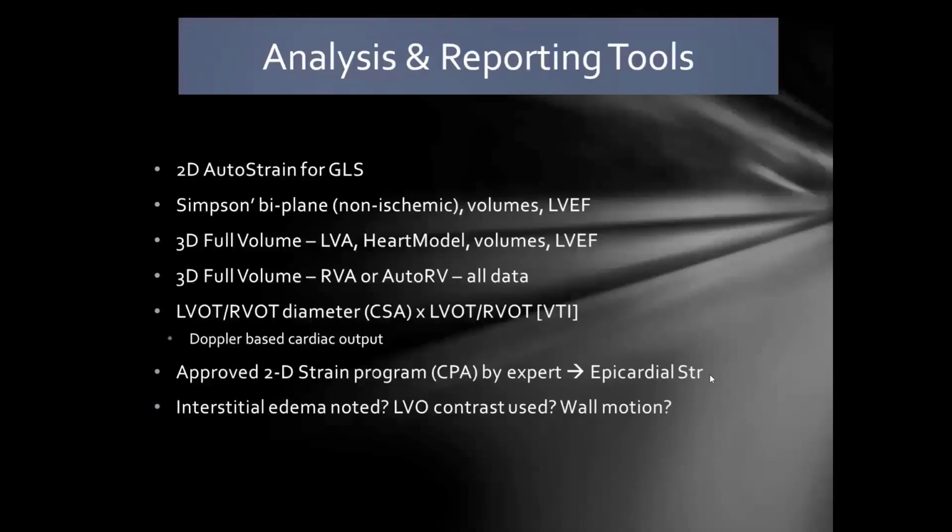That's completely the call of the center, and I strongly would say this is going to come from our major centers that do this kind of work already, and they're going to share that data in cohorts. So, it's not a recommendation. I'm just saying that if you get the images, you'll have possibly what we need to learn very important information down the road that will affect our assessment by echo and what we can report down the road.